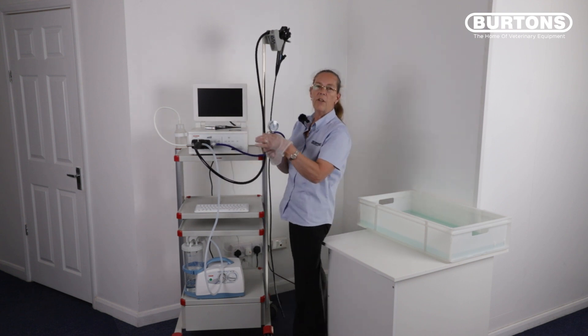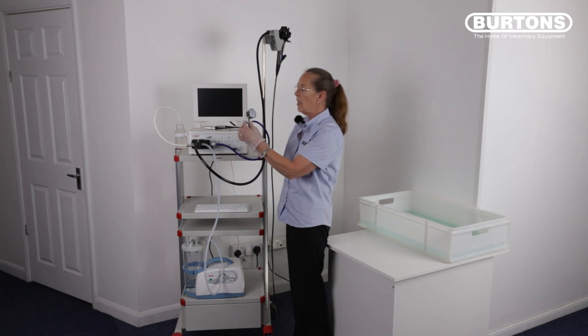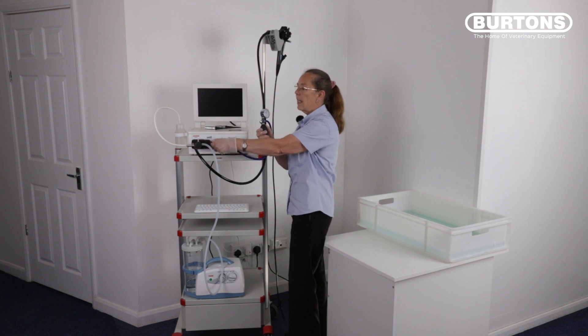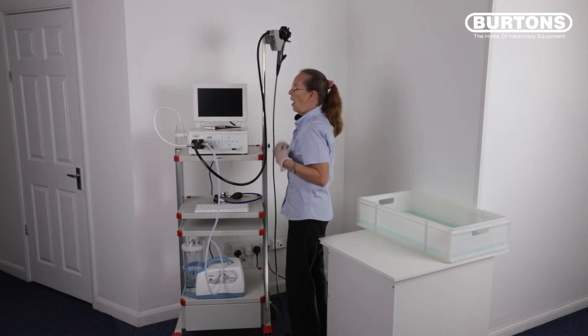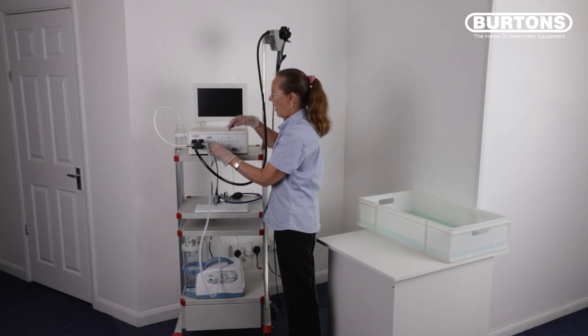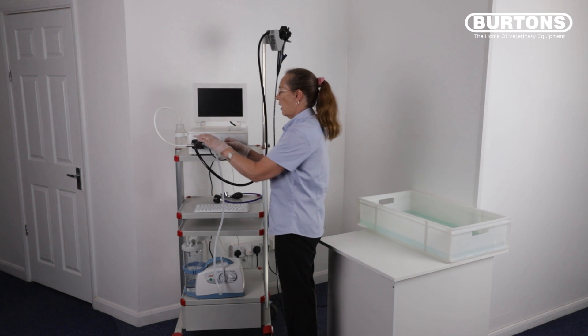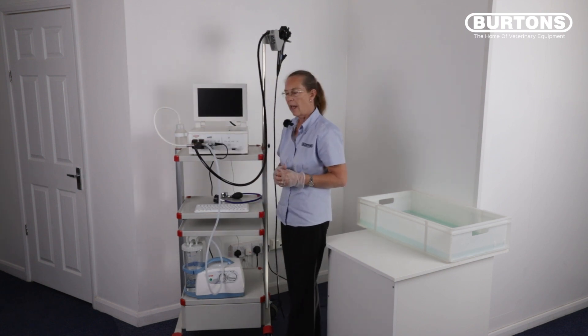If you're confident that you don't have any leaks in the scope, the scope is fine to be cleaned and disinfected. Depressurize the scope by turning the dial. Disconnect the leak tester and the waterproof cap from your scope and reconnect your signal cable. There is a red dot on the signal cable that aligns at 12 o'clock on the processor and the red dot that aligns at 12 o'clock on the connection on your video endoscope.